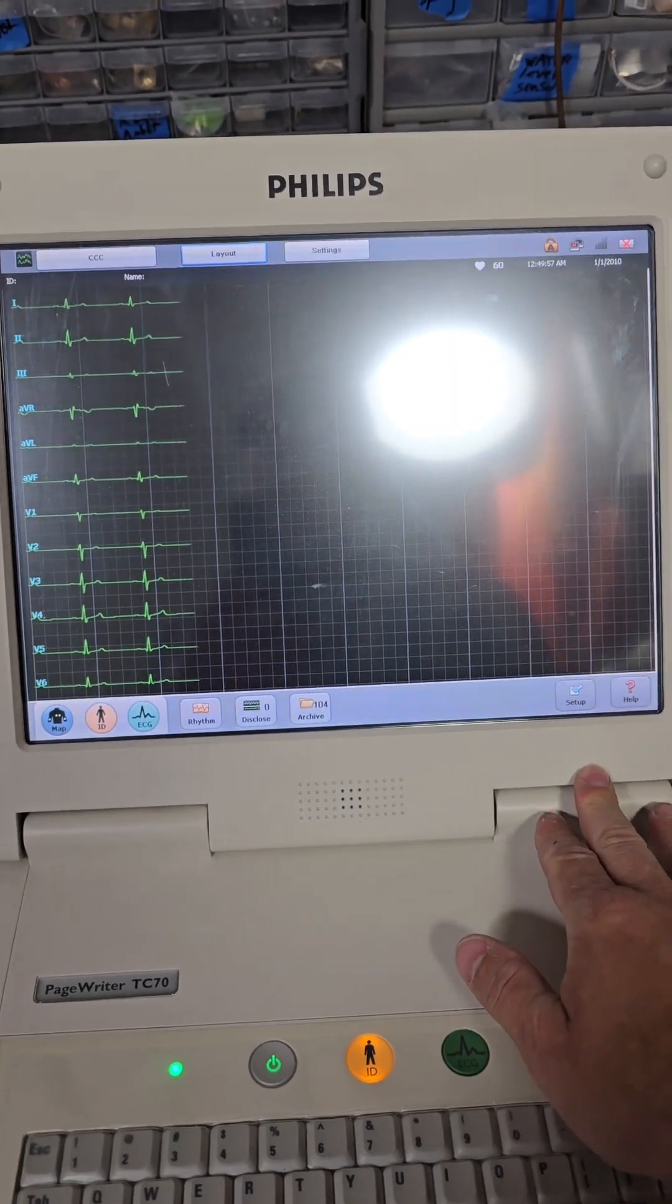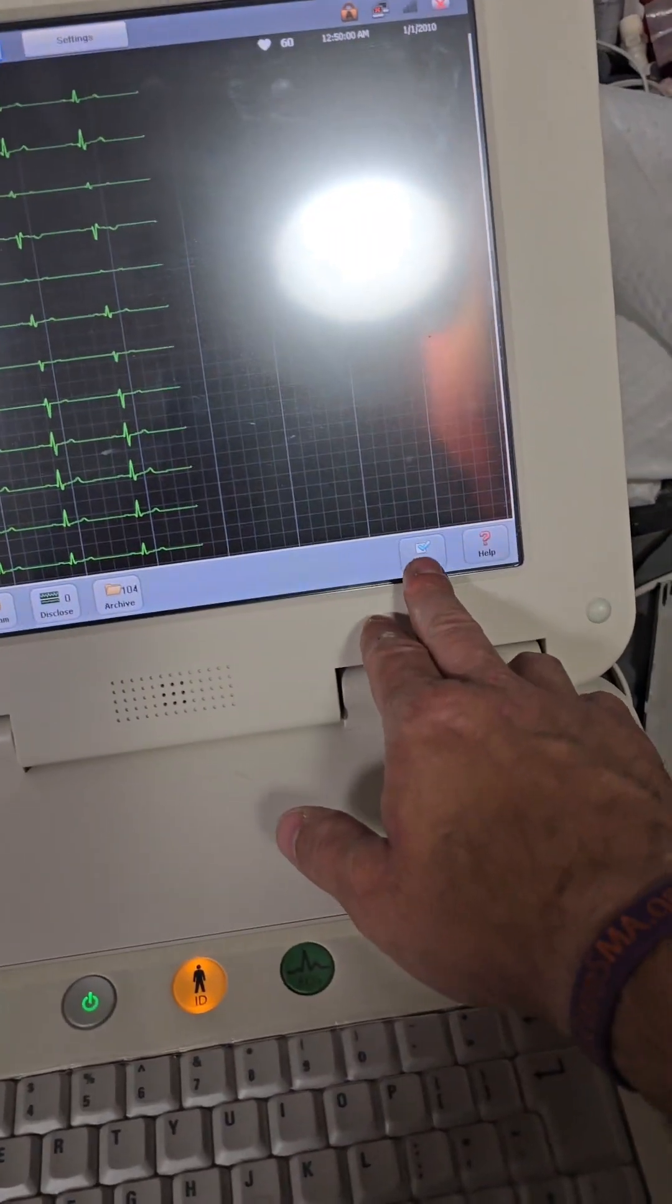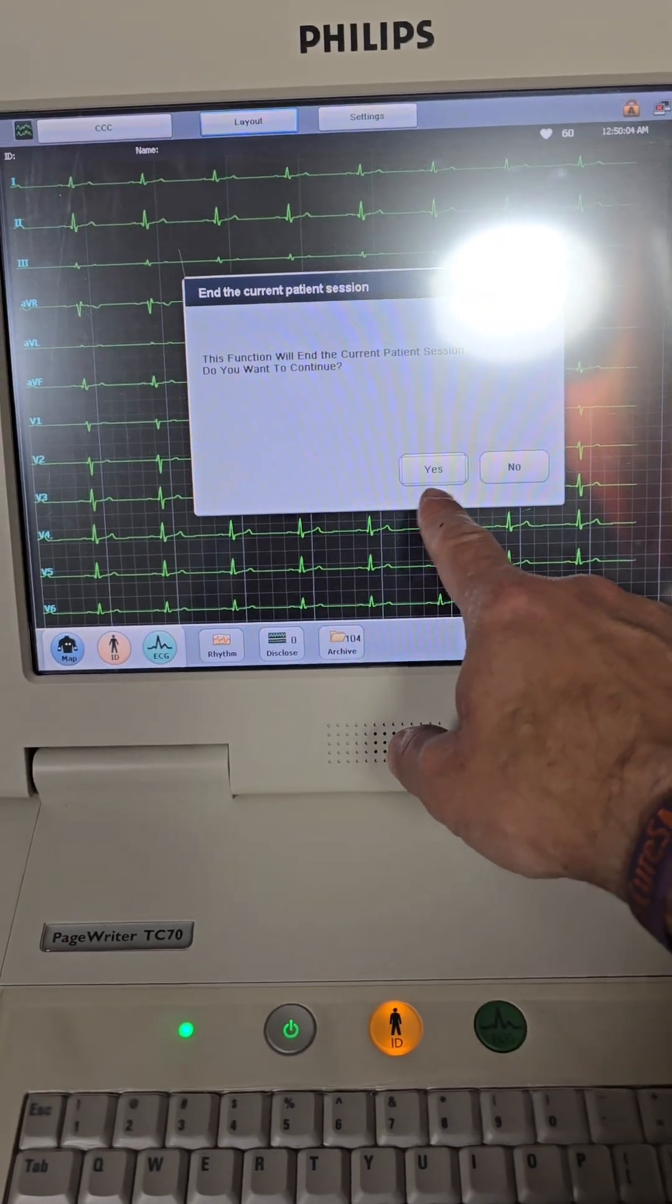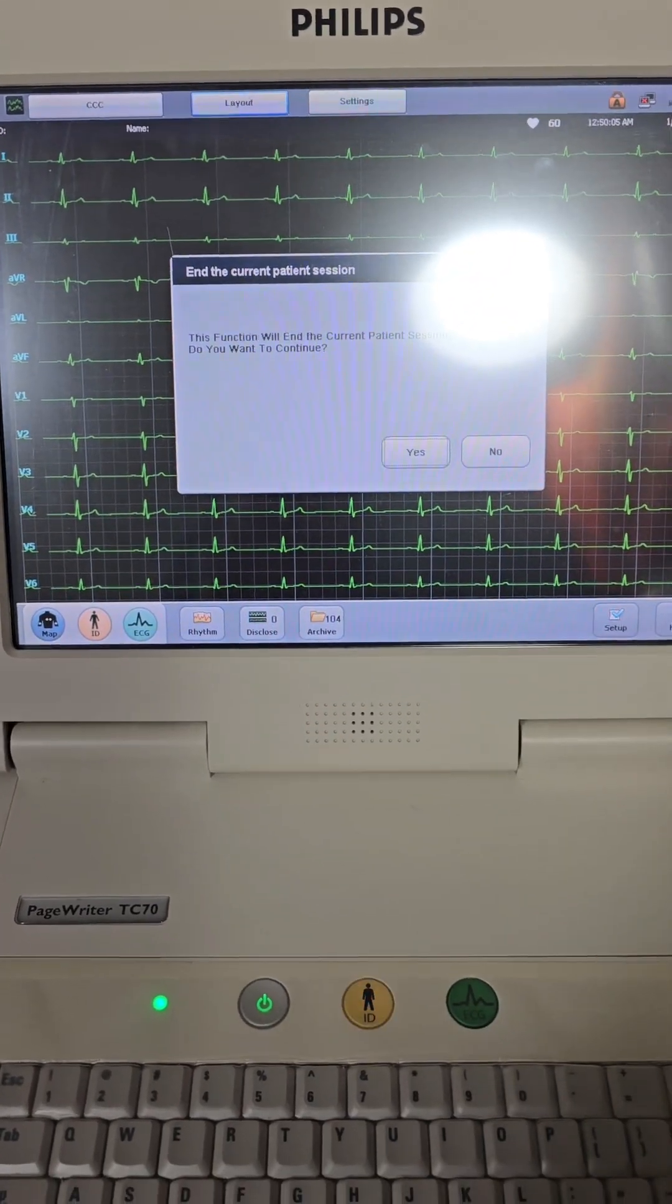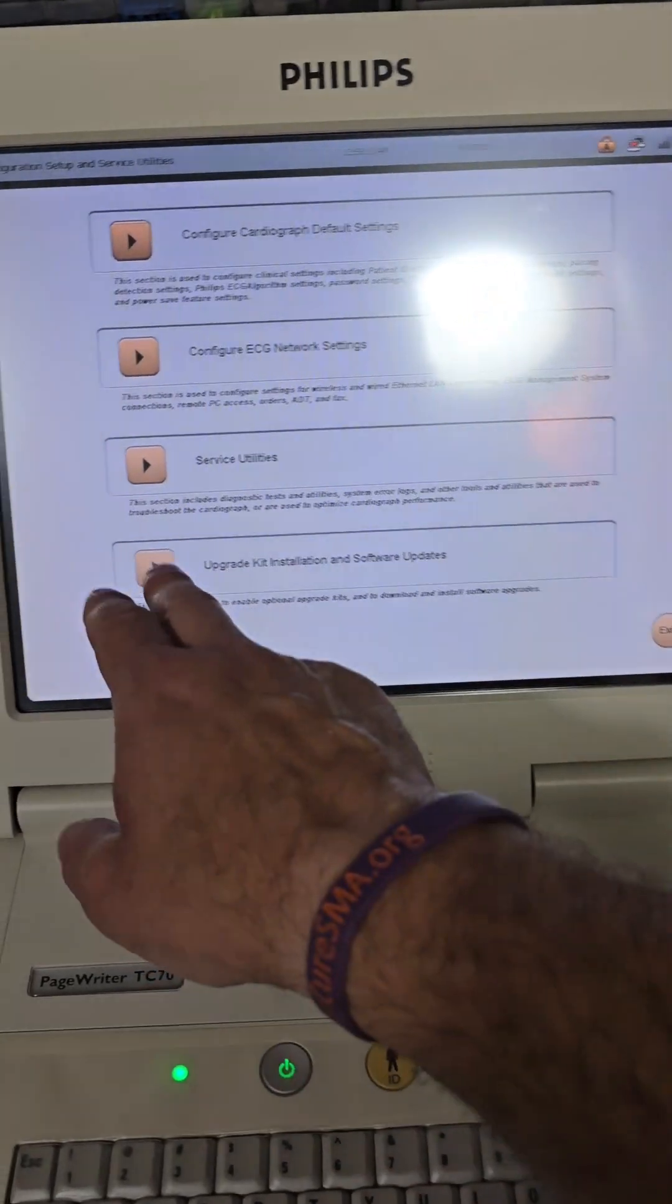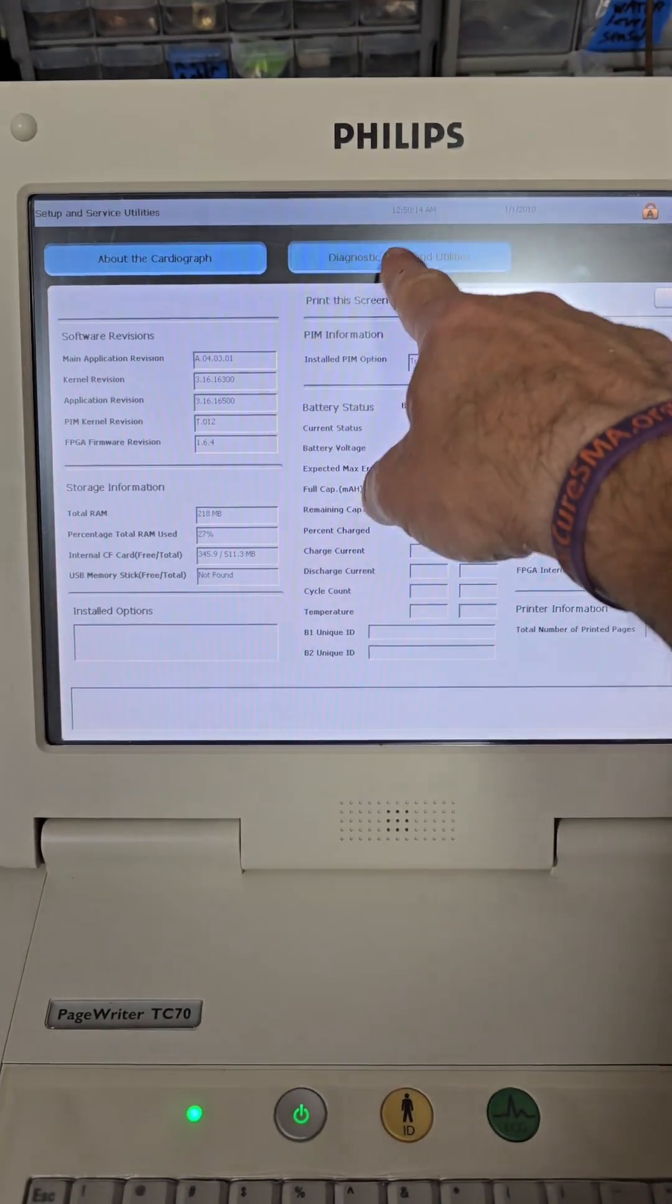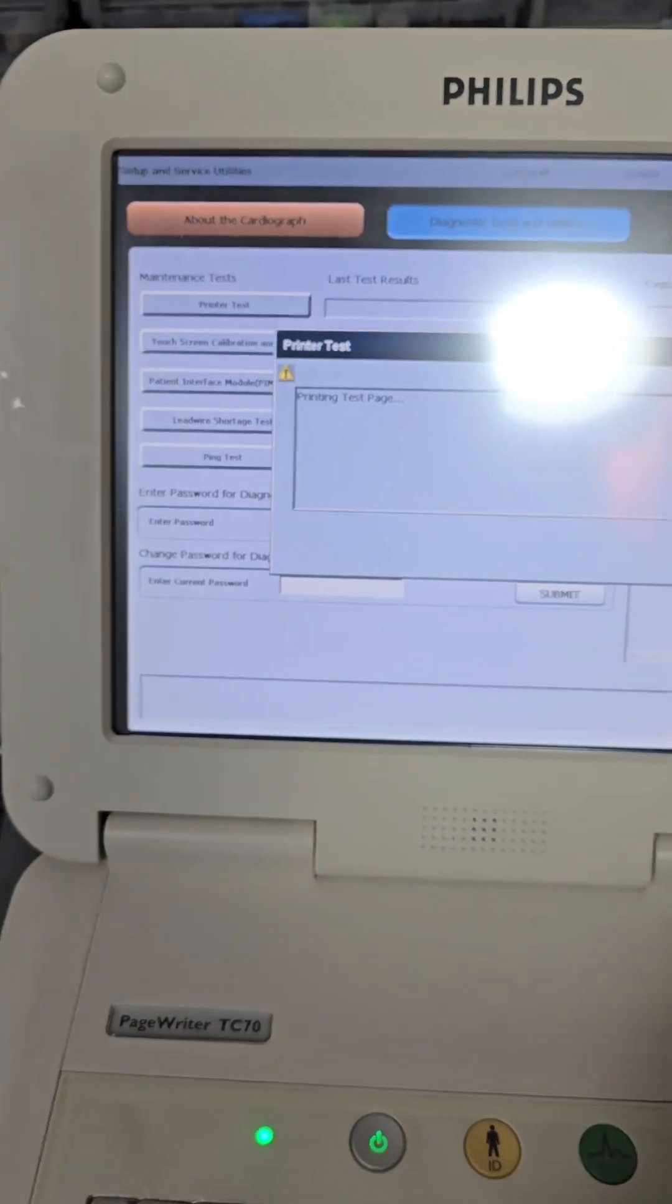So, to get into configuration mode and do all your tests, hit the setup button down here. Okay. There you go. No password needed, but service utilities, diagnostic tests, and printer tests.